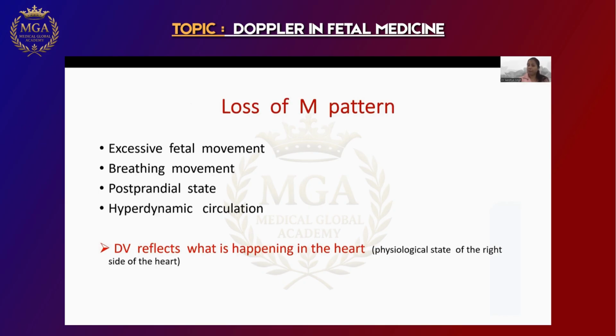So whenever this M pattern is lost, kindly wait before reporting. The baby should be quiescent. The baby should not move. The excessive breathing movement should not be there. If the mother has just eaten and come, the baby will move. A lot of energy. So just wait for some time before you report that there is an A wave abnormality or whatever is happening. All Dopplers should be done when the baby is not moving at all and is quiescent.